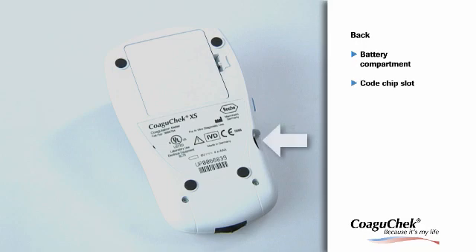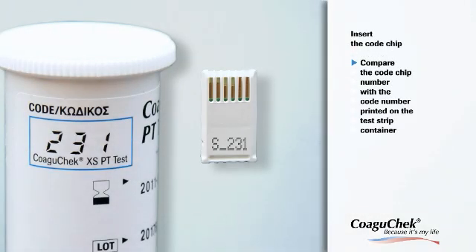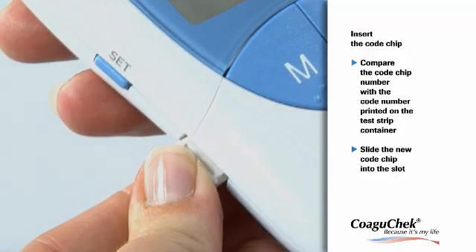The code chip slot is on the right side — this is where the code chip has to be inserted. Please ensure that the number on the code chip matches the number on the label on the test strip container. Slide the new code chip into the slot on the side of the meter until you feel it snap into place.